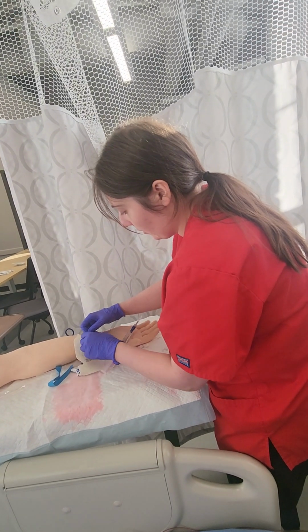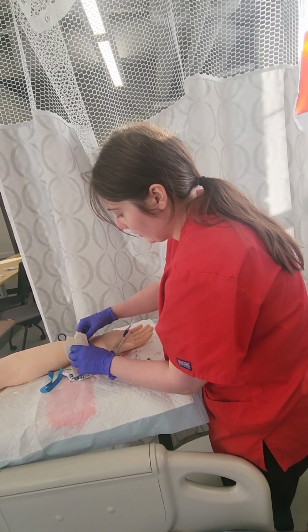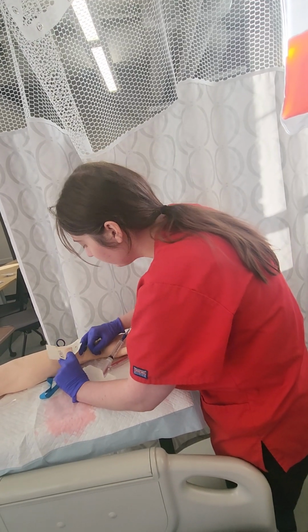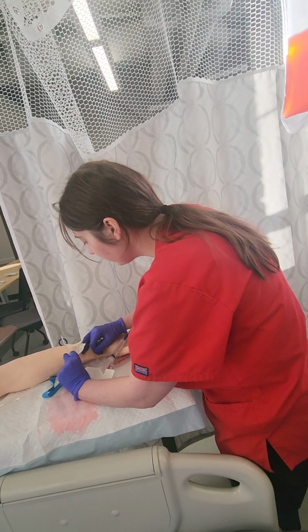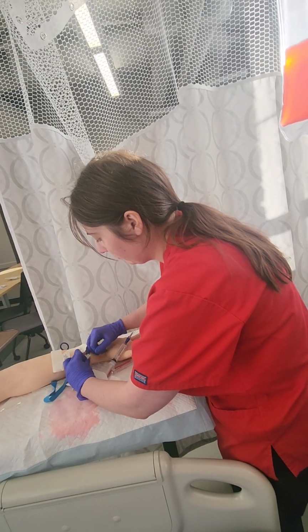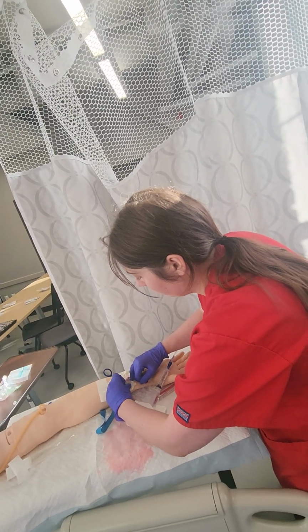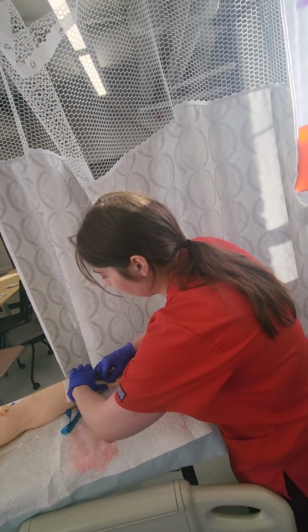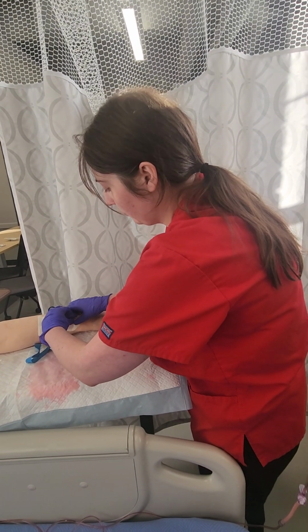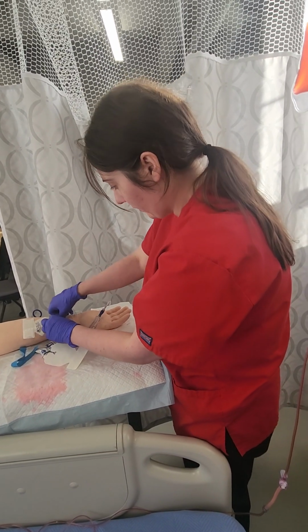Now to get this sticker on you, while holding it steady with my hand. Okay.